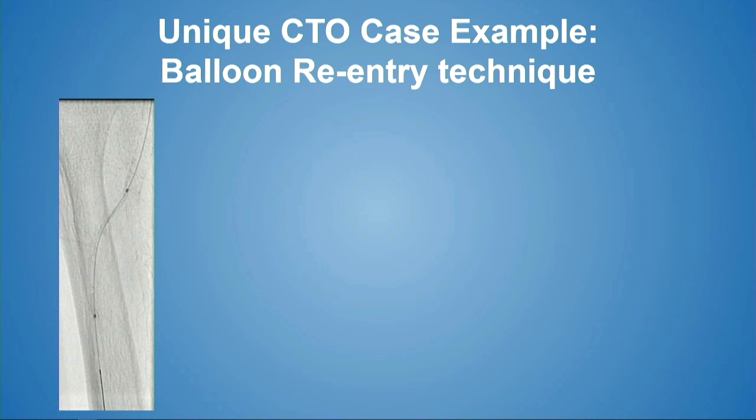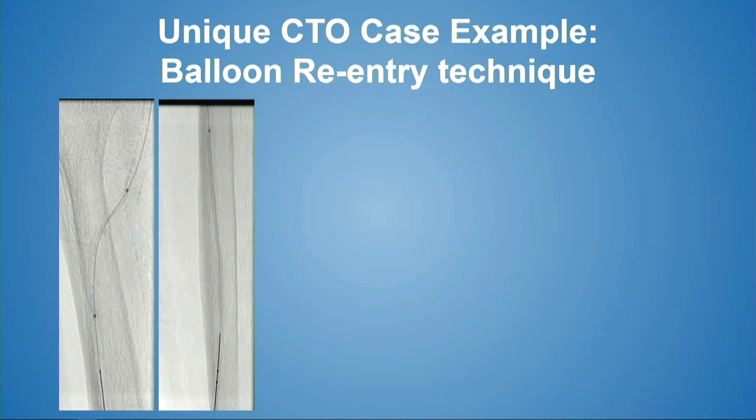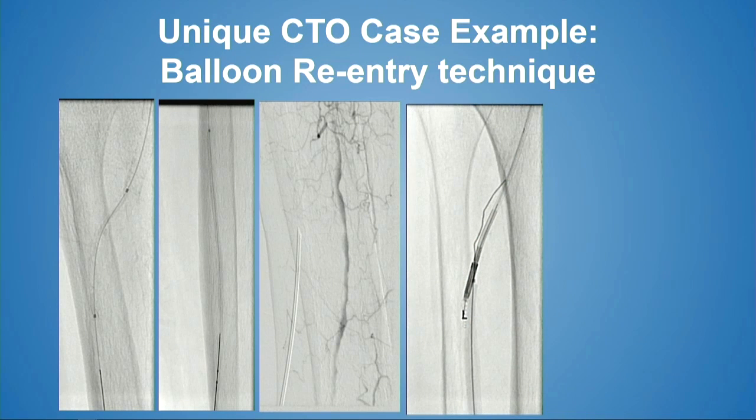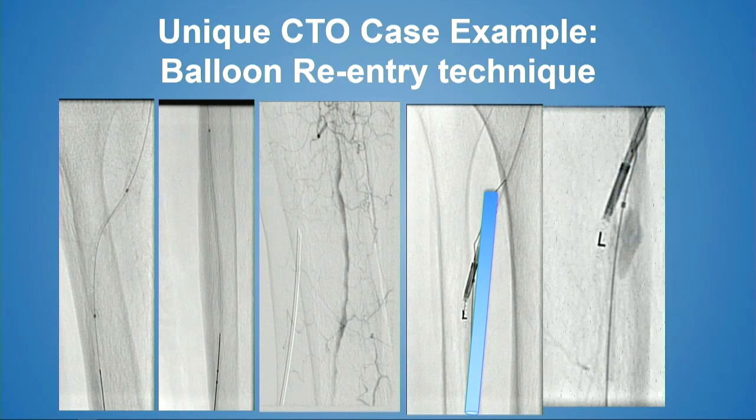Like Mandy was saying earlier, would you ever balloon proximally before you get distally? In this case, we actually did balloon to be able to see distally. And because it was such a lousy reentry site distally, we were able to recanalize by going retrograde through this ugly looking AT. Ultimately, a balloon was placed from below, and the Outback catheter was brought from above. To get the two lumens to connect, the balloon was punctured. So this was a below-the-knee reentry using the Outback into a segment.